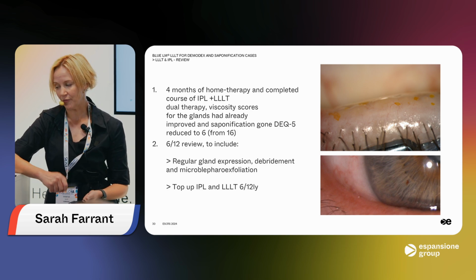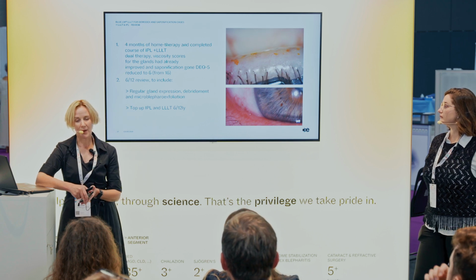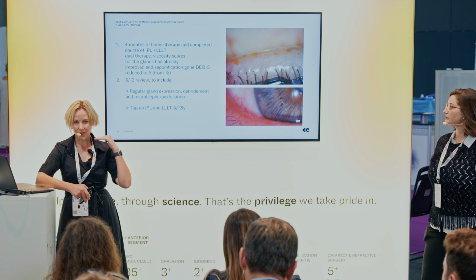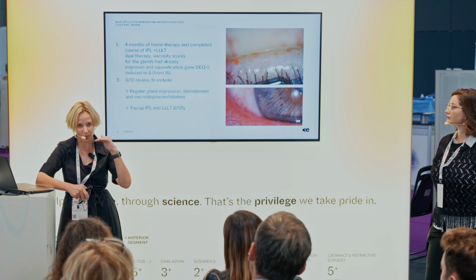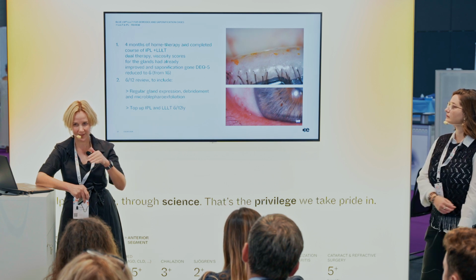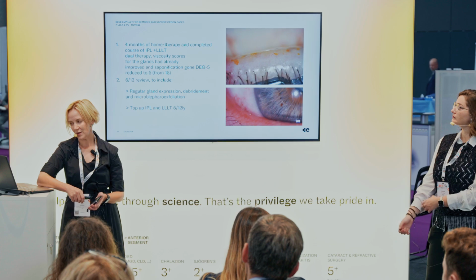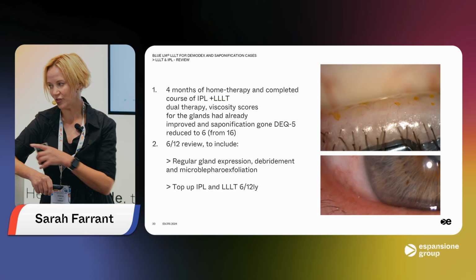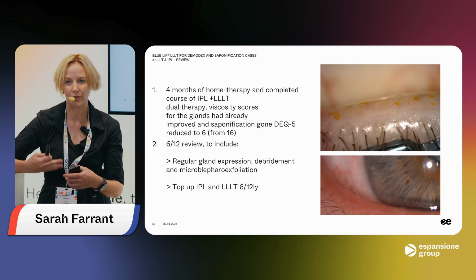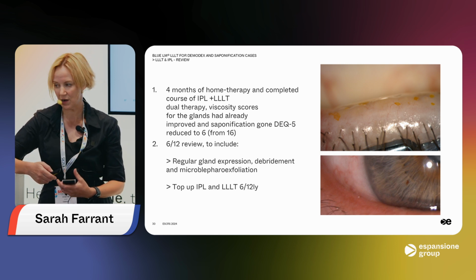So then our plan moving forward was to repeat that process of treatment every 6 months. So my aim is always to hit a level where we're in a kind of sweet spot, and then put it on cruise control, just keep them ticking over at that point. And if something changes, if something digresses, then just match that change in what we're doing in the journey. And quite often what I'll find is that if things do change for a patient, then I'll just increase the frequency with which I'm seeing them and doing the light therapies and doing expression, and that just kind of pulls it back in again, and that can work really well.